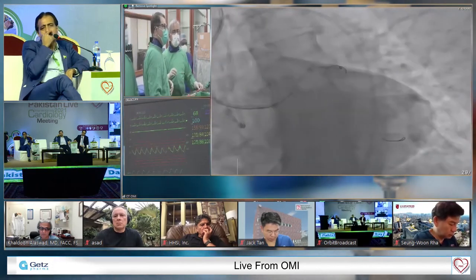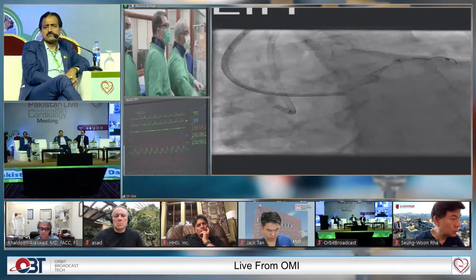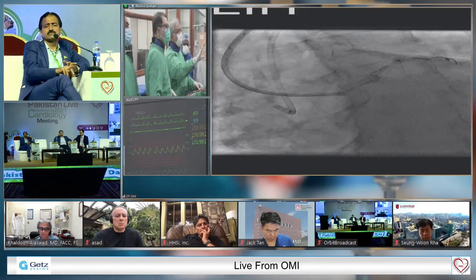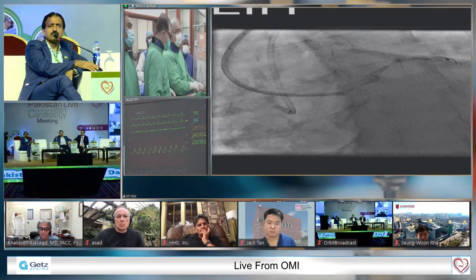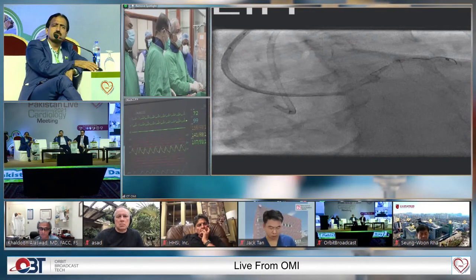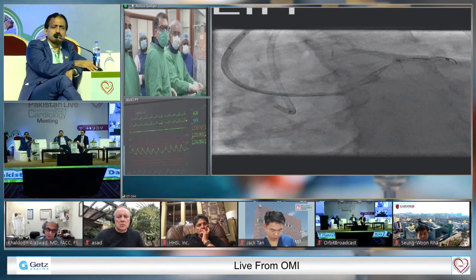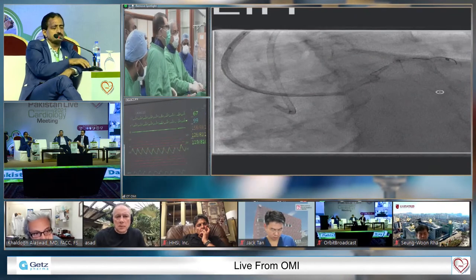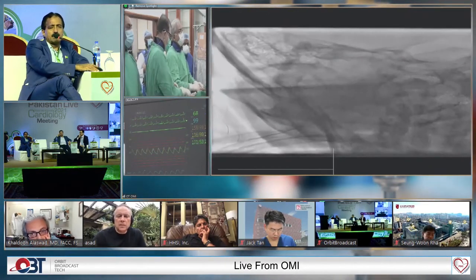Now we're going to go live where we are right now. We're now live to get the wire into the side branch. We'll make the current live screen what you're going to see. You're just seeing the side screen. So now we'll try and show you the main screen. Bashir, how much time do we have for the live transmission? Another 5 minutes.